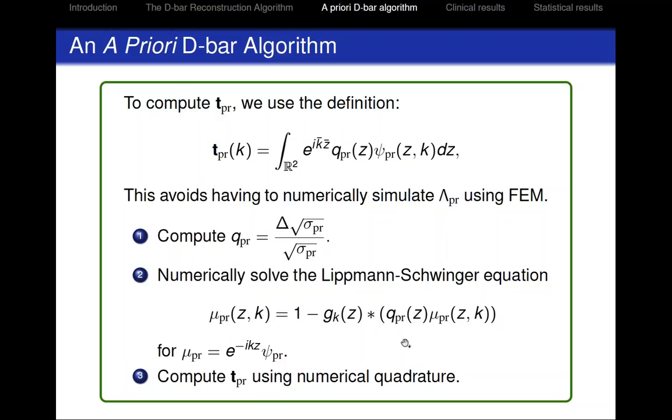Yeah, carefully chosen grids. So we do two grids, a fine grid and a coarse grid, but that isn't necessary for convergence of the method. It just speeds it up. Okay, thank you.